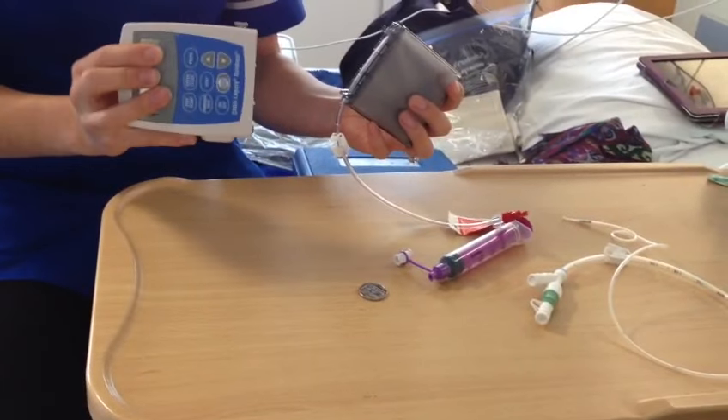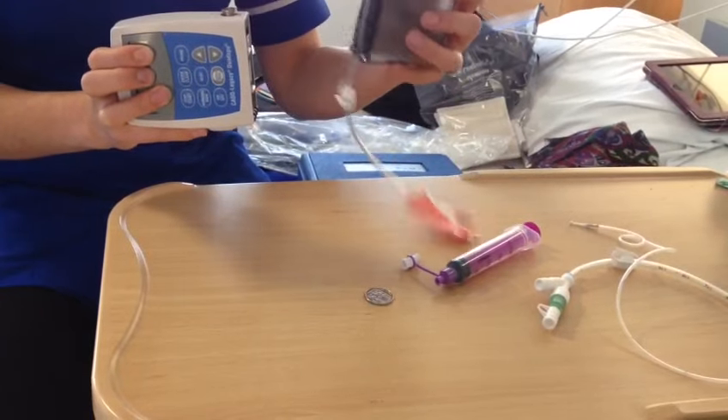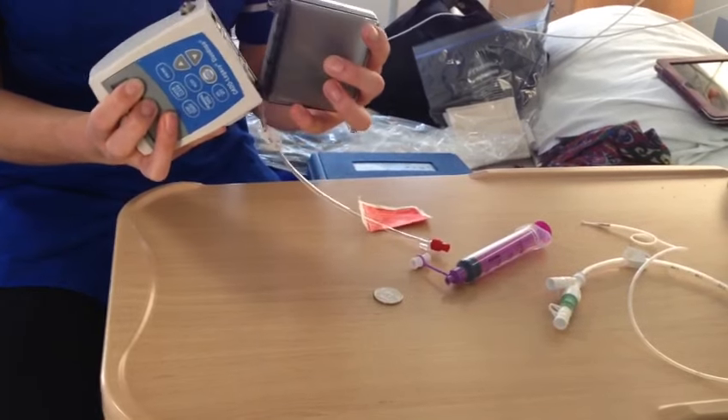To set up the pump, you want the pump in your left hand with the buttons facing you and the cassette with the tail hanging down. You want to make a V shape and then close it.